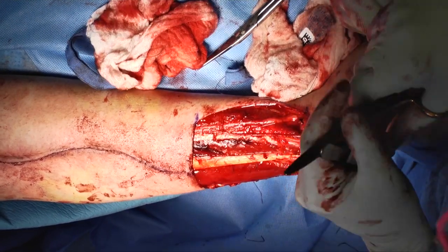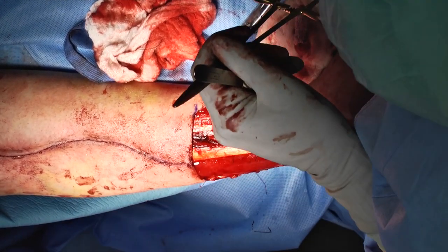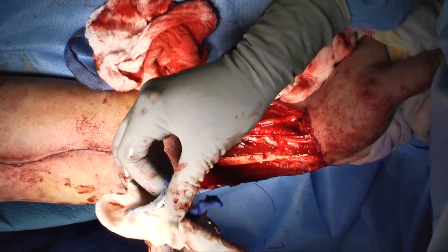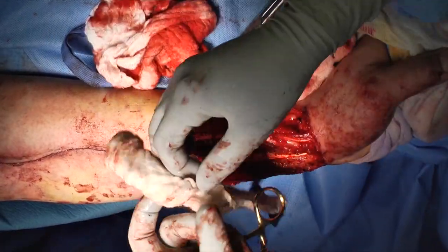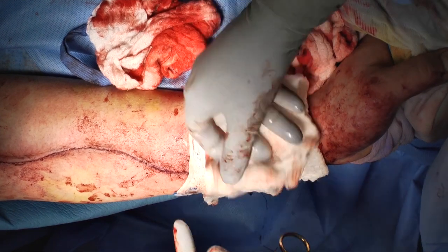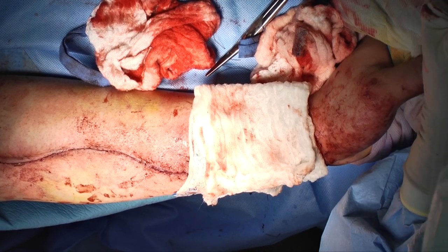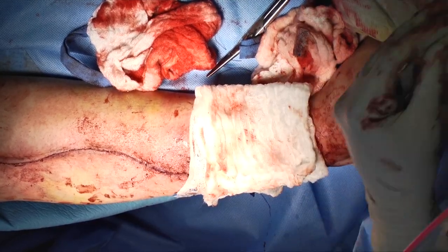For the harvest of that skin graft, we use the Zimmer Dermatome set on 0.020 inches. The skin graft is placed over the wound, circumferentially sewn into place with a chromic suture, and small holes are placed in the skin graft in order to allow for egress of serosanguineous fluid. These holes should not be placed over tendons. After the placement of the skin graft, seroform dressing and a volar splint is placed over the wrist.